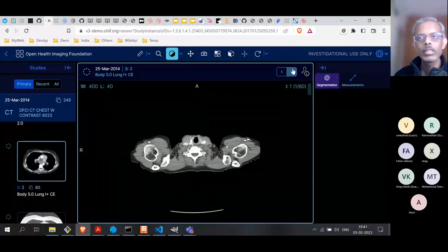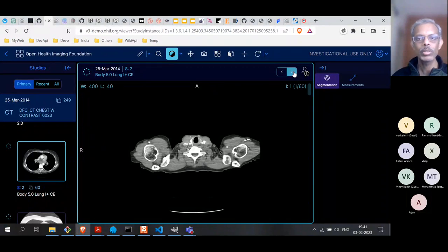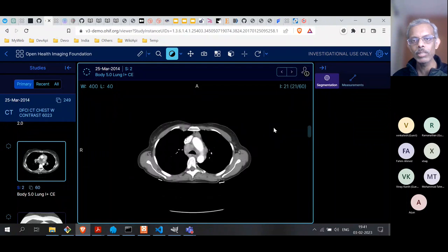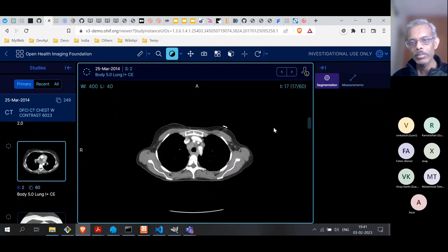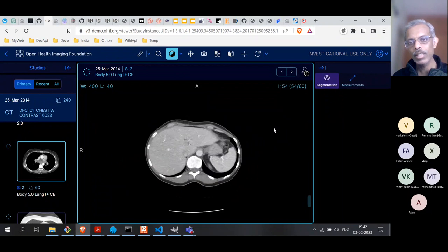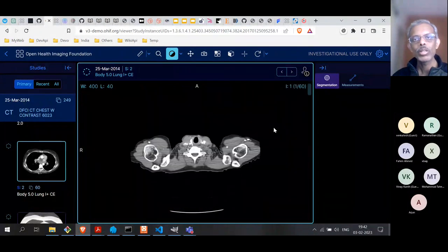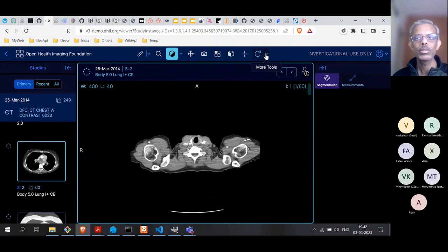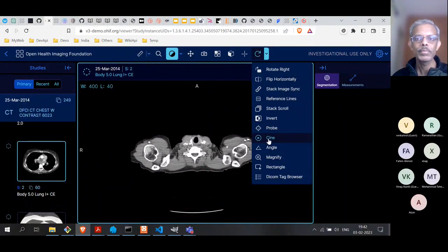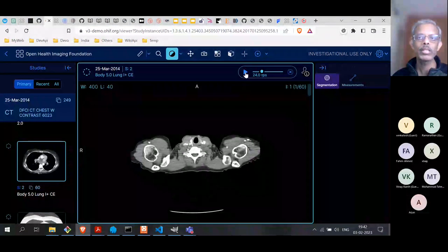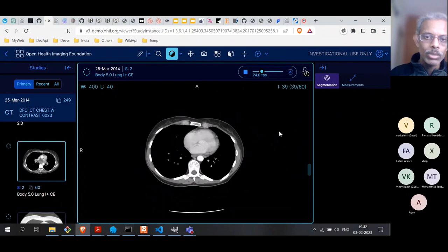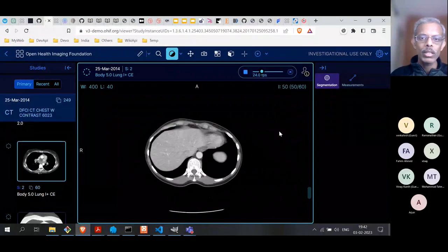This one has 60 images. You can move to subsequent images by clicking, and you can also scroll down. As you scroll down, you see how the image changes — there is some continuity, because the scanning machine takes different slices around that body part. You can also play this as a video within the software. There is an action here called Cine, which takes a default of 24 frames per second. So automatically it plays. These are the kinds of tools which are important to surgeons, doctors, and radiologists who are continuously looking at these scans.